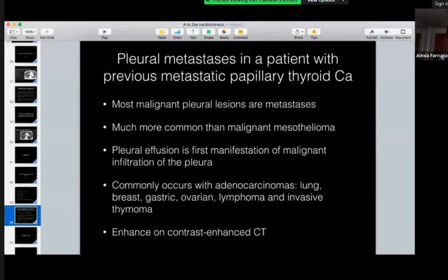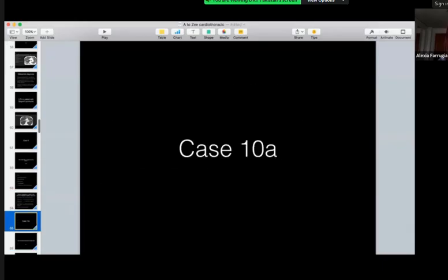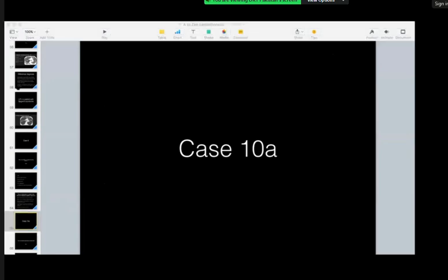So well done. Are you ready for the next case? Yeah. Okay. I'll just prepare your images.